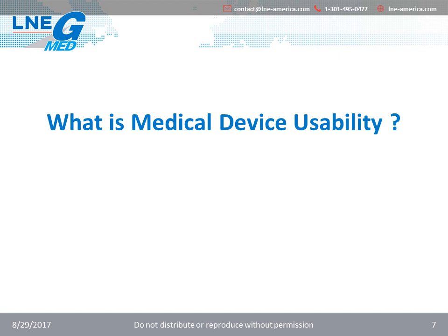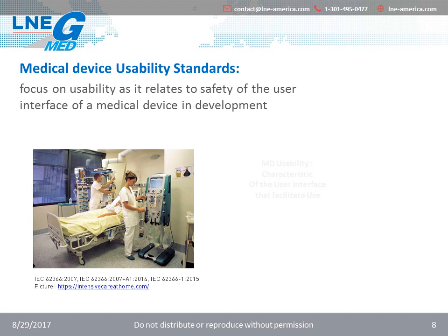What is medical device usability? Now that we have an understanding of what usability is in general, let's talk about the definition of usability of medical devices. Medical device usability standards focus on usability as it relates to safety of the user interface of a medical device in development.